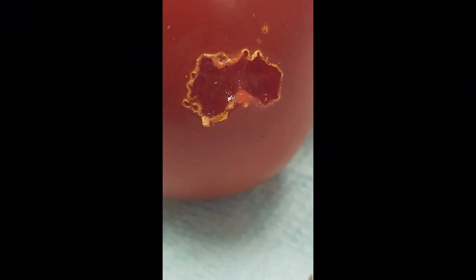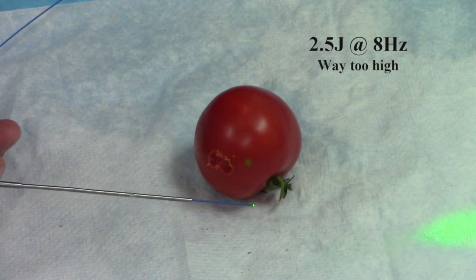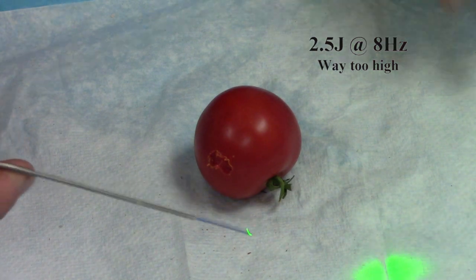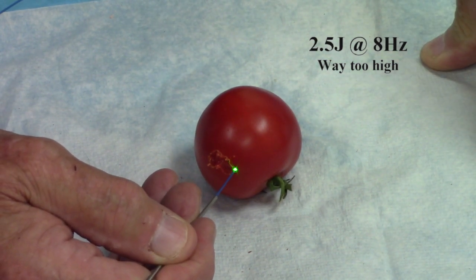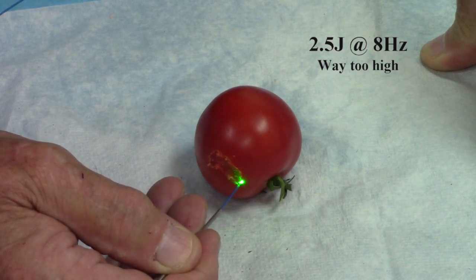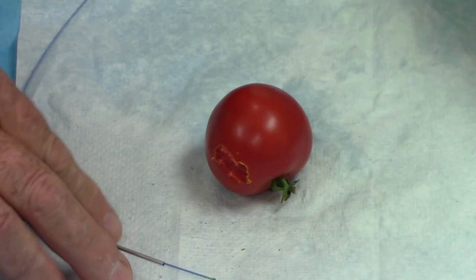Now I've turned it down to 600 millijoules or six tenths of a joule at 12 times per second for 7.2 watts average power. Now let's use a setting which we should not be doing in open air because it messes the fiber tip up, but we'll deal with that. We're at 2.5 joules at 8 times per second — and that's actually splattering me in the face.